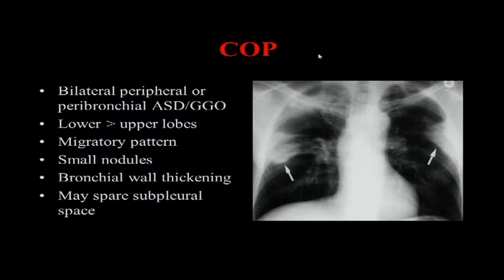Tope, two more differential diagnoses for fleeting pulmonary opacities. At 4 p.m. it's like this, at 10 p.m. it's like that. They keep changing. I'm not sure. What else? Anybody else? Very good. And? Pulmonary hemorrhage, no. No. No. Eosinophilic pneumonia, pulmonary edema, and COP: fleeting opacities. Sometimes pleural effusion also can be included in that depending upon patient position.